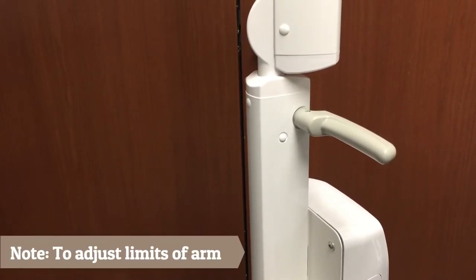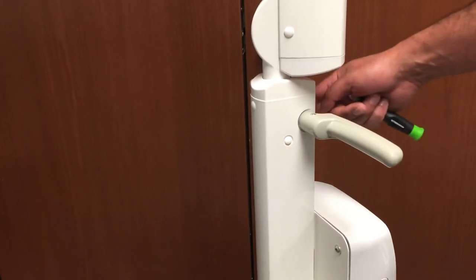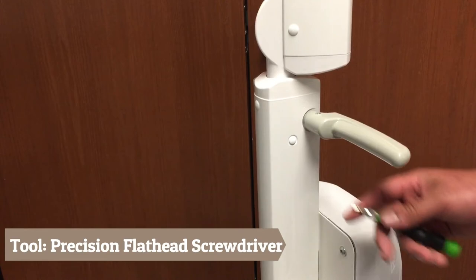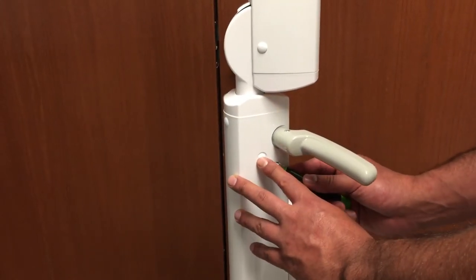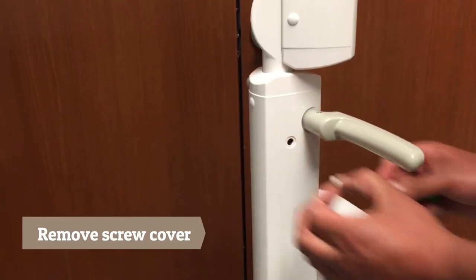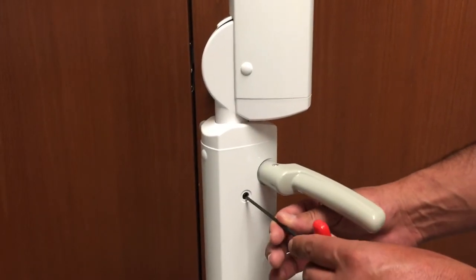If the horizontal limits of the scissor arm need to be adjusted, remove the screw covers on the side of the upright and adjust the dog head screws on each side of the upright using the 3mm Allen wrench to the desired position. Step 9: Once corrected, replace the screw covers.